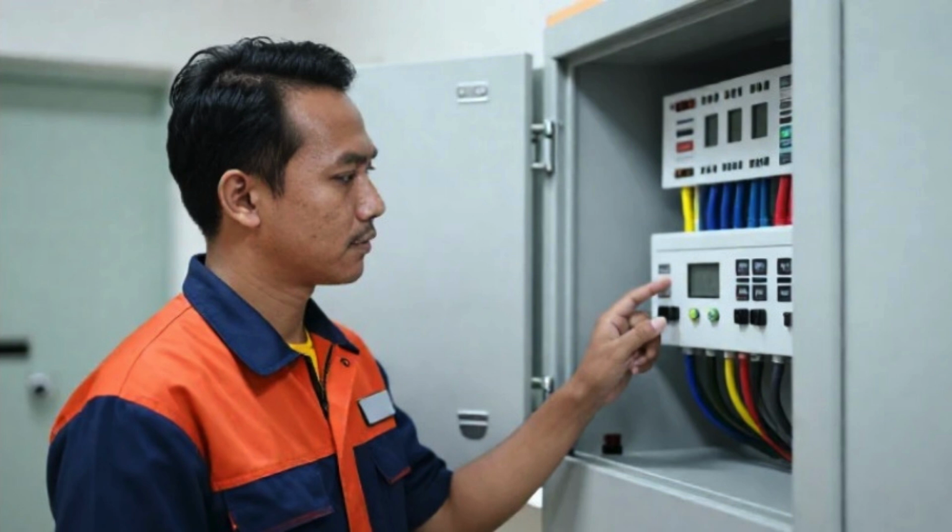Another important concept is the classification of applied parts, such as Type B, Type BF, and Type CF. These classifications indicate how closely the applied part is connected to the patient and how strict the leakage current limits must be. Type CF equipment, which is often used for cardiac applications, has the highest safety requirements because it is directly connected to the heart.